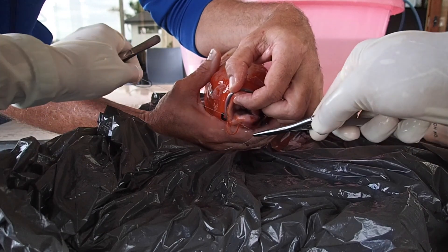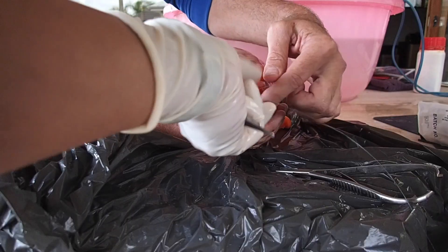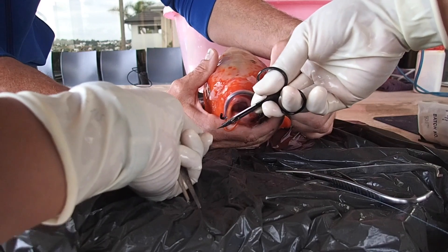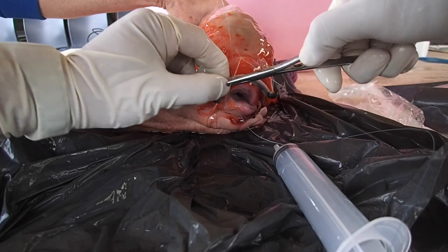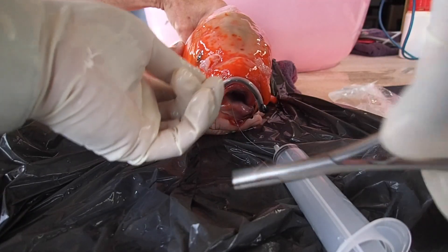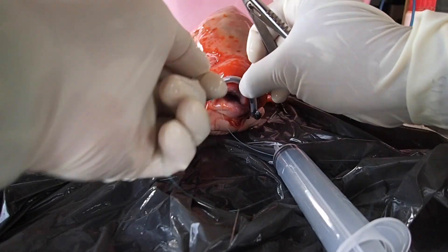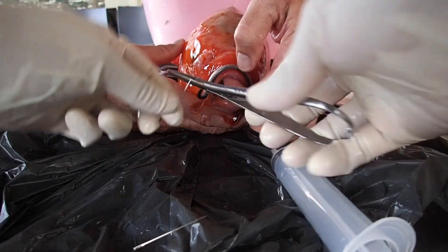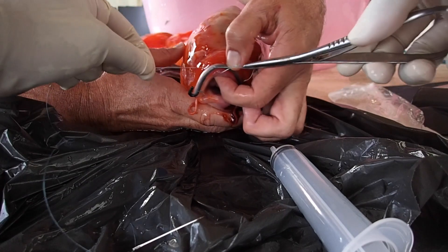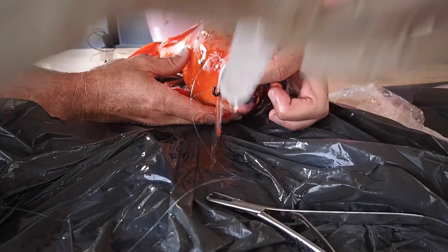When we're tying this knot, we're making sure that we don't tie it too tightly to prevent any compression of the soft tissues around the lips. The suture material we're using is nylon — it's a monofilament — so that stops wicking of water and bacteria into the points of entry and exit.